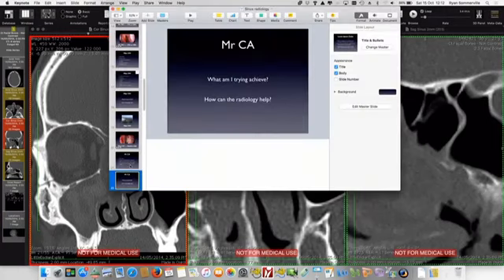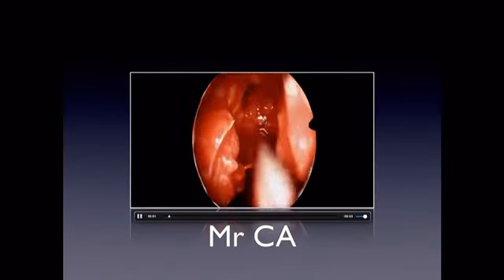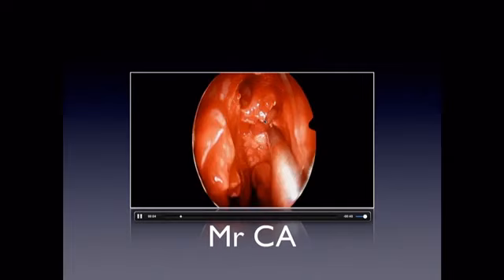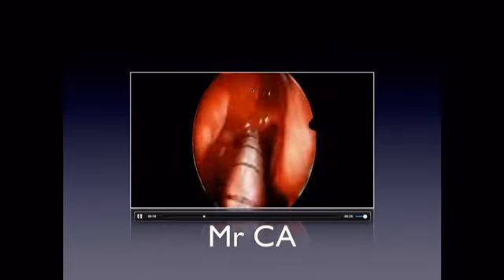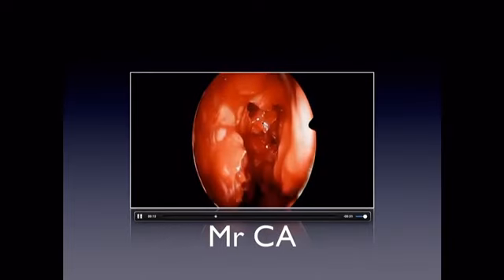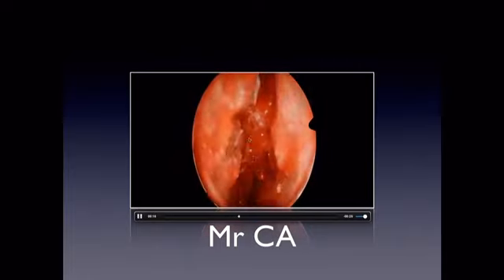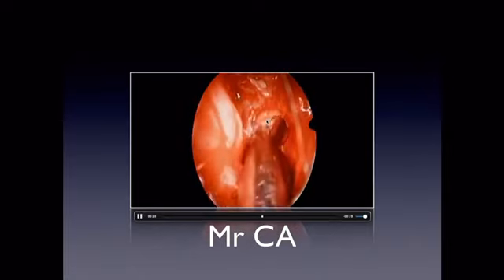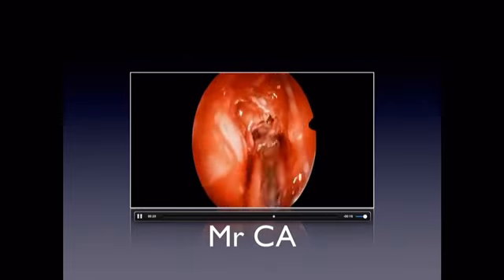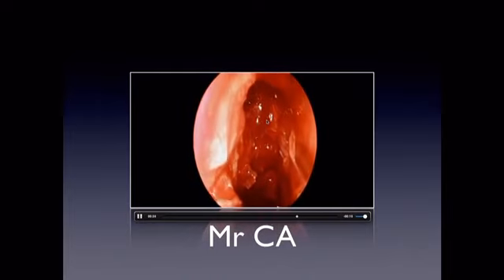And I was called to assist just recently in a patient who had just that sort of thing happen, but fortunately they didn't have any problems with the actual muscles. It was just periorbital fat and an anterior ethmoidal intraorbital bleed, which we fixed for her. So this is at the end, basically after I've removed all that inflammatory disease. I didn't show you that bit before because it was full of blood, it was red everywhere. But just here is the dehiscent lamina. So we're going beyond all that, leaving a little bit of disease on the lamina there. We're not taking that down. And obviously, if I didn't know that was there and I was using that microdebrider, stroking like we do, pulling across that lateral wall there, it's very easy to suck it in when it's moving at 5,000 revolutions per minute.